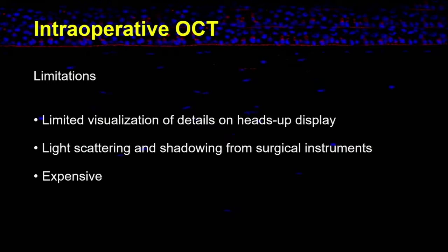And one of the other big problems is the expense. It is an expensive piece of equipment, and some argue that experienced surgeons can make do without it. The other thing to remember is that we still don't know whether this actually affects the clinical outcomes in the end. The Discover study didn't actually look at that aspect.